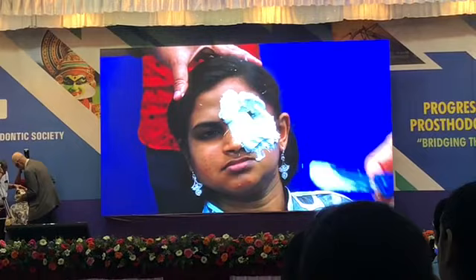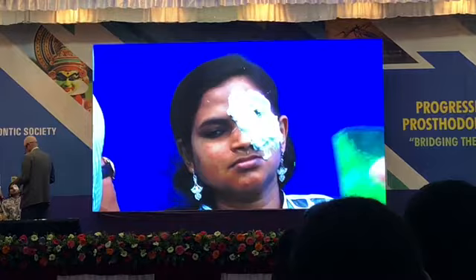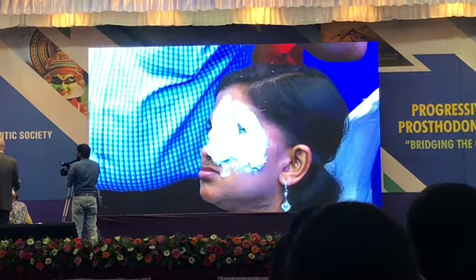Why can't we just do two pours instead of three? What do you mean, two pourings? Two layers instead of three layers. We need it thick enough so it doesn't break. Can we increase the thickness now? You could, but it's hard before it's set, because you start pushing it around. You saw how we were pushing it around, it would thin out.